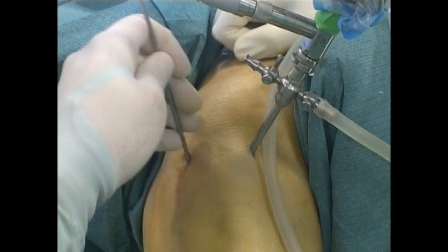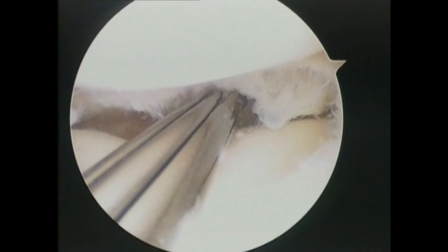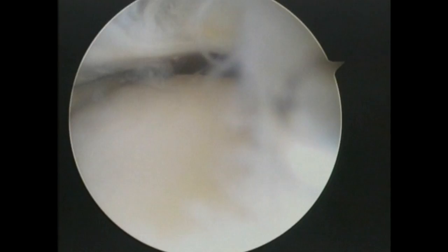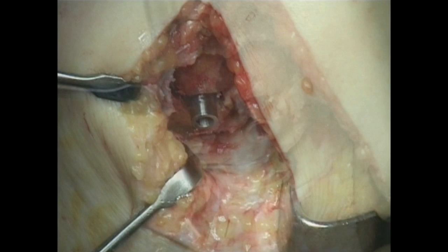The same tibial resurfacing procedure can also be performed through the arthrotomy incision used for the implant of the femur component. Meniscal sparing is guaranteed also with this technique. The preliminary arthroscopy is useful in order to evaluate the state of the articular cartilage and menisci. In arthrotomy tibial resurfacing, it is advisable to first prepare the femur site in order to gain better exposure of the posterior portion of the tibial plateau.